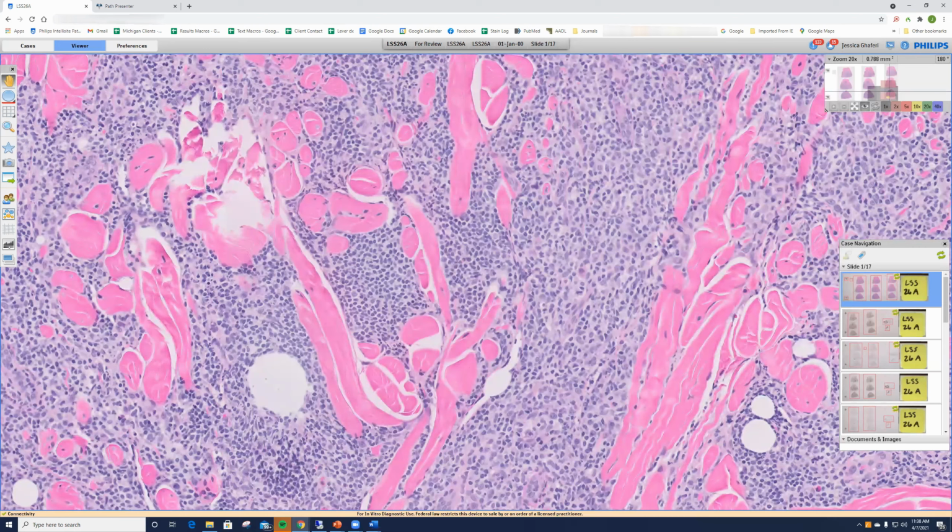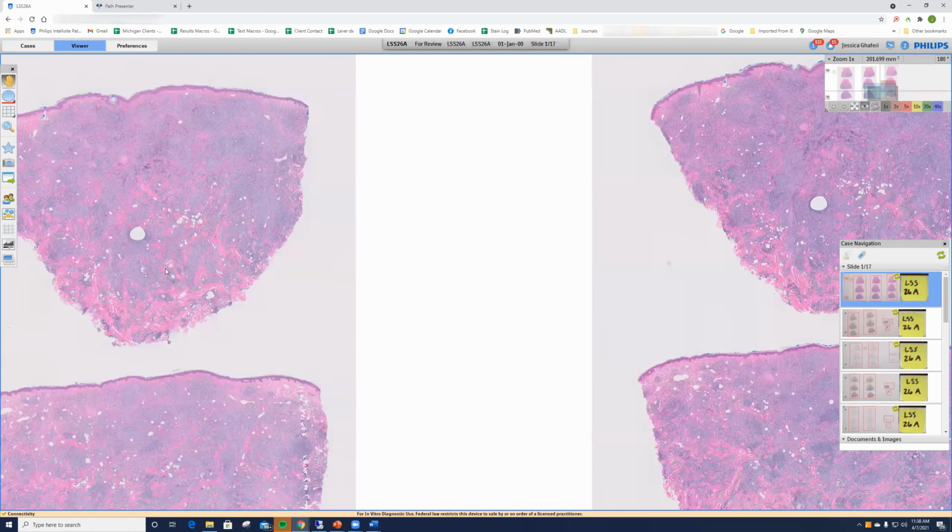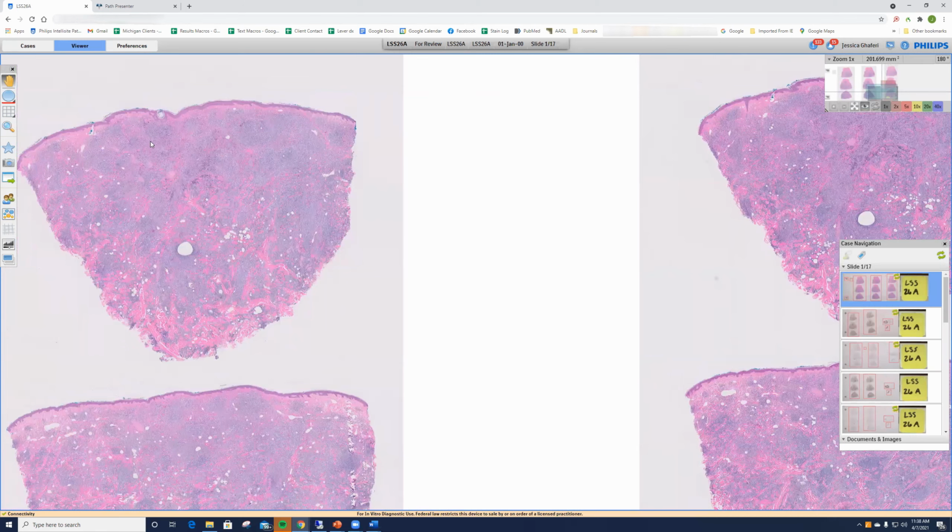These are CD20 positive, CD79A positive, BCL6 negative, CD5 negative. And the differential diagnosis here is pseudolymphoma. Often what you'll see here is this kind of vertical growth pattern with streaming down through the dermis and extending to the subcutis with that typical Grenz zone.